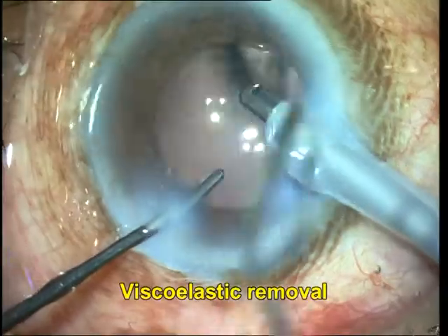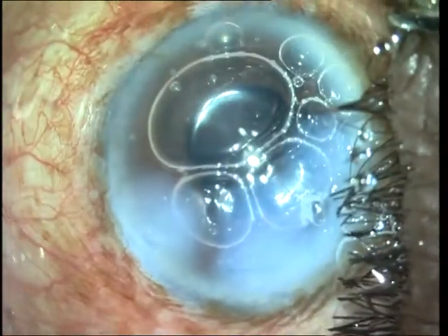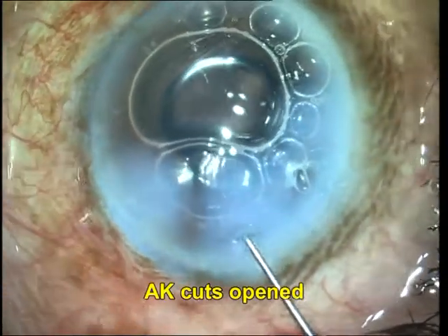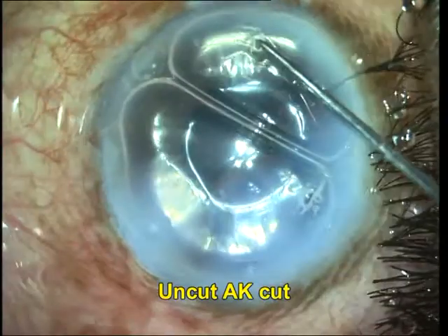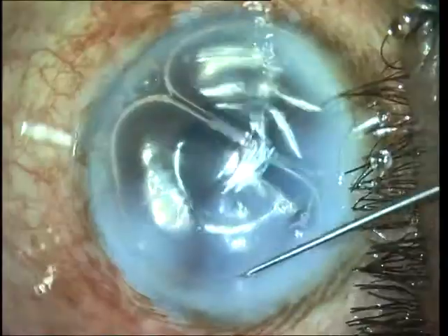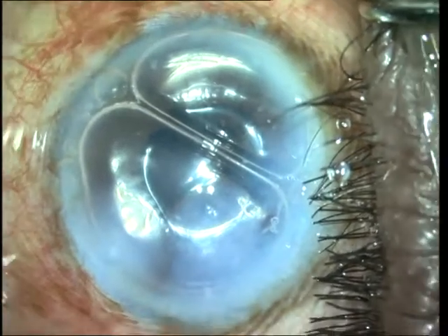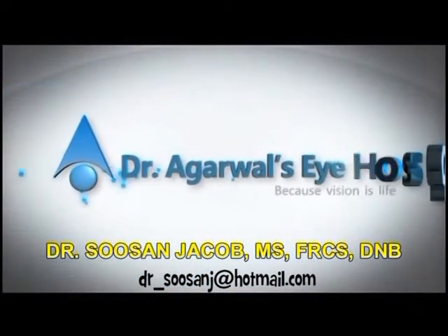However, cortex removal can generally be completed, and finally the intraocular lens is implanted into the bag and viscoelastic is removed. At the end, the arcuate keratotomy cuts are opened. You can see here an uncut arcuate keratotomy cut — these are some of the problems that you can sometimes face even with FLACS. I do hope you enjoyed watching this video, thank you so much.